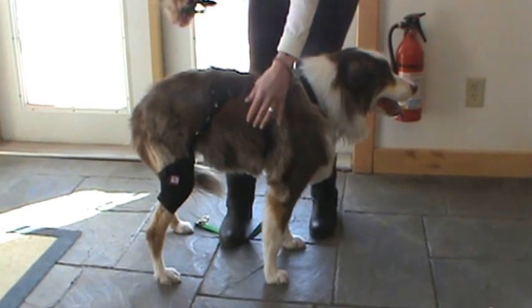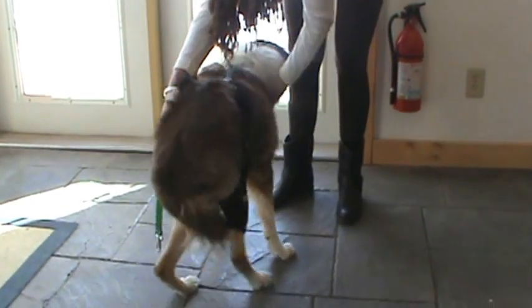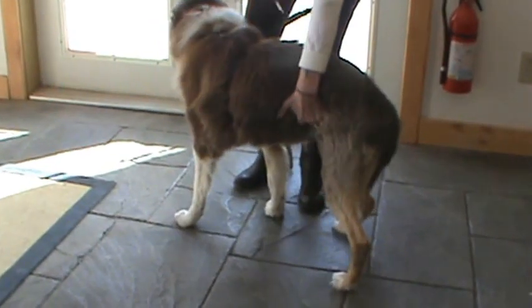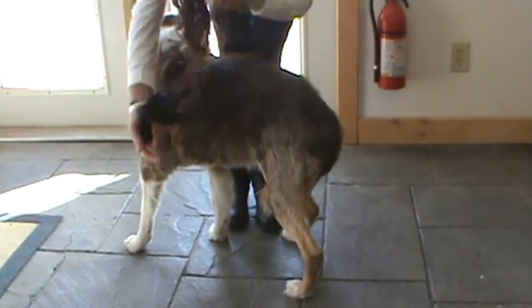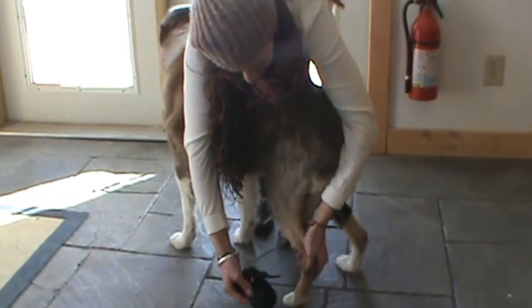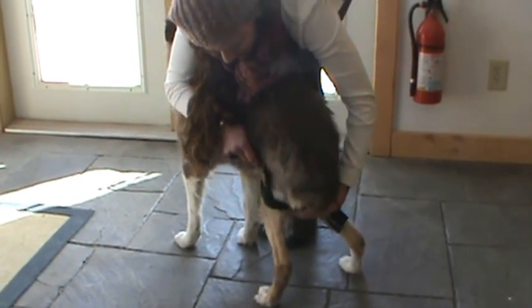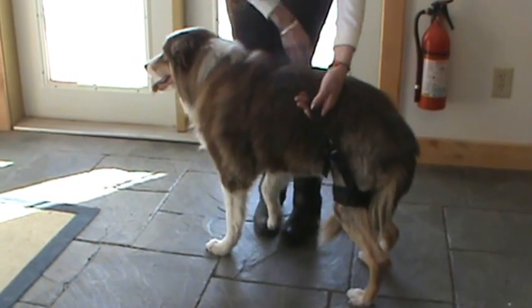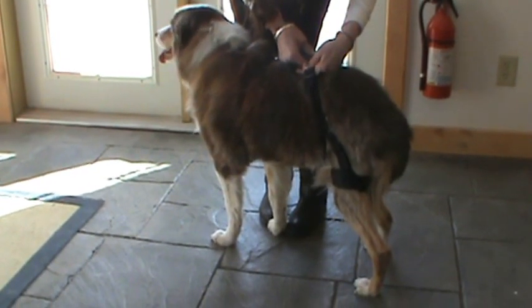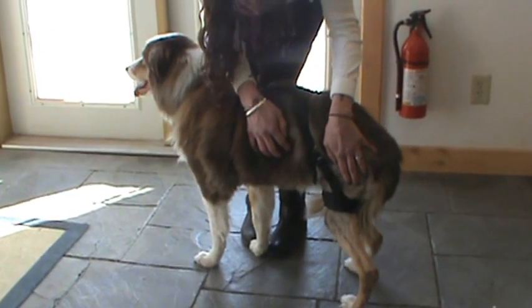If Angel will just turn around, we'll show you how to put on the cuff on the other side. So you just take the cuff with the webbing strips to the outside, slip your dog's leg through the hole, bring it up, and then all you have to do is take that side and buckle it to the other side. As you see, the side view of the webbing strips — they are facing forward and it is completely off the hip.